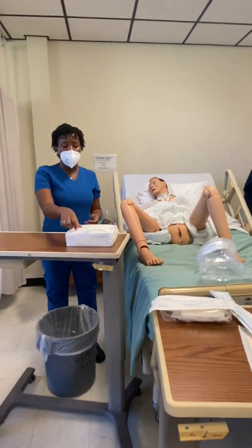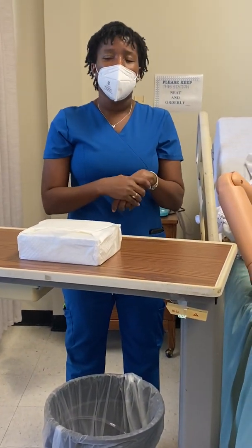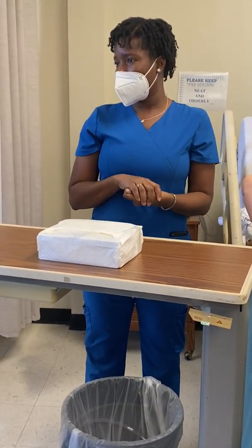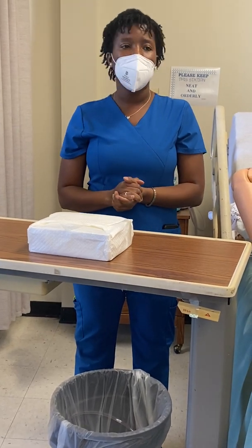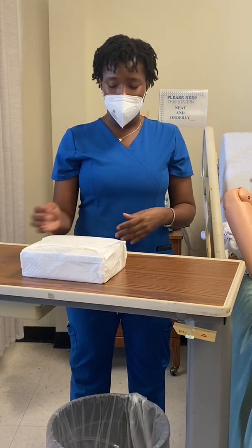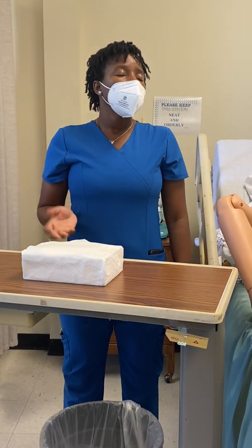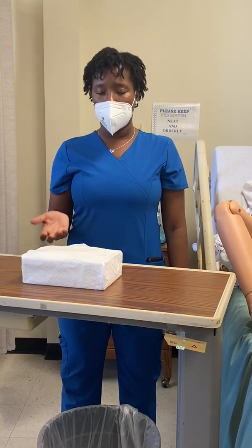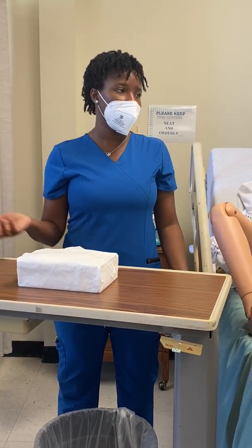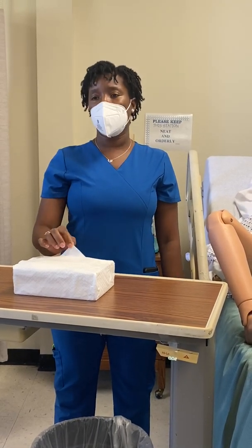Okay? Now, so you see how my sterile field is sitting? Do I have the right to flip it around? Yes. Do I need to flip it around? Yes. Why? So you open it away from you? That's right. You got that from your lecture. Good job, okay? So, I fixed it the way I want it. Make sure you look at it, you guys. That's like setting yourself up if you don't. Because they're all just about like this. But don't panic if you don't have this little flap sitting here.